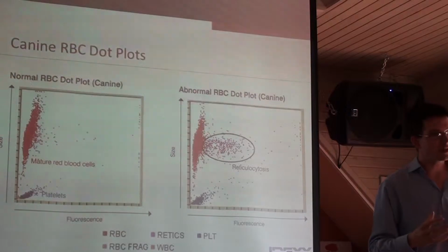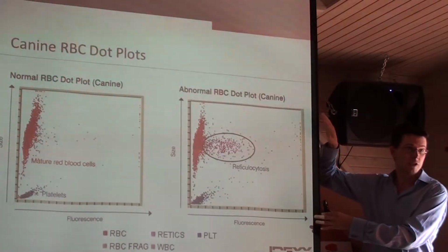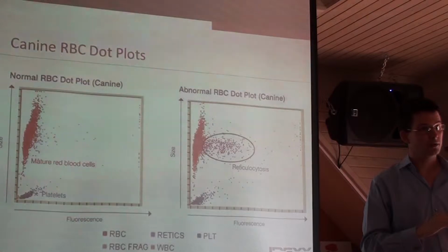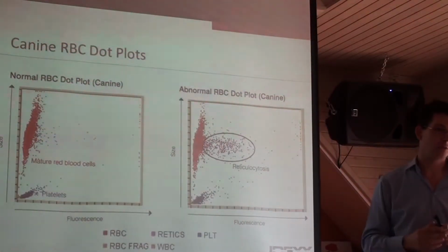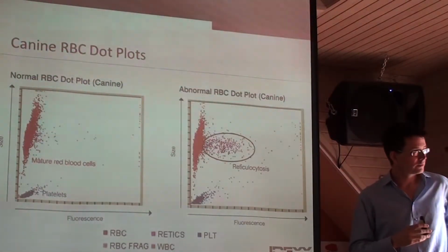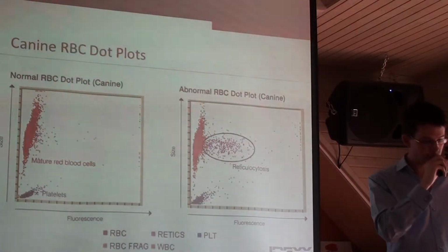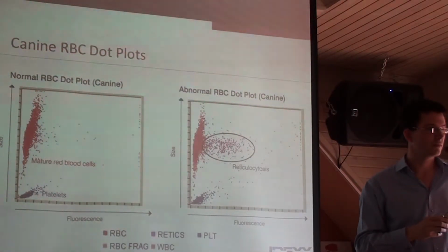I often say to veterinarians that this is the truth, whichever analyzer you are using, this is the truth, and the numbers that you see on the report are a computer's interpretation of this dot plot.